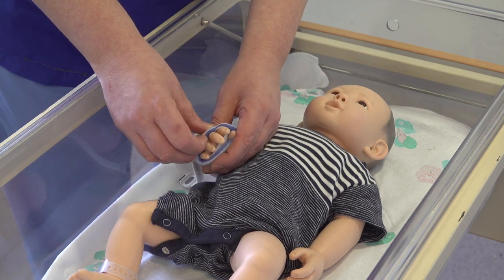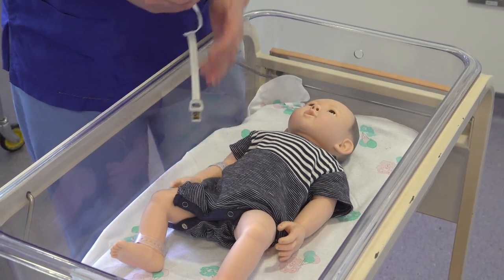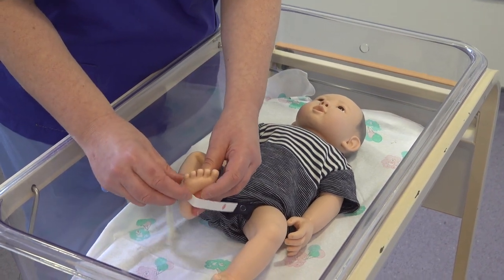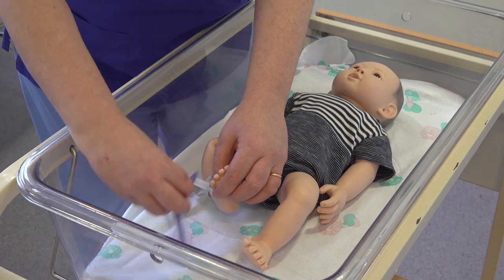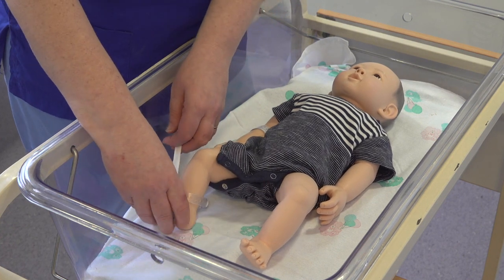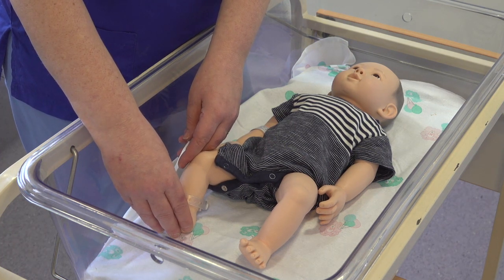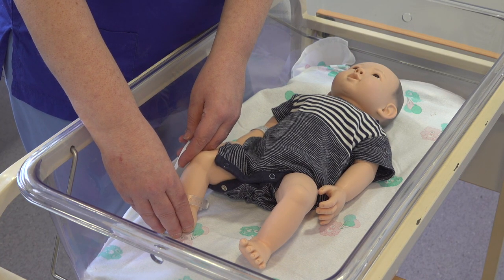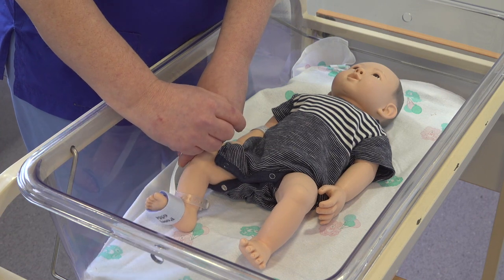You can use the same probe and we're now going to look at a post-ductal saturation. You can use any other limb for the post-ductal saturation — the left foot, left hand, or right foot. Place it in situ, put the saturation monitor on with a small posy wrap, and attach your probe to your monitor. Hold the foot to minimise movement so it doesn't interrupt the reading. Get your reading and record this as your post-ductal saturation. Also record which limb you took it on — the right hand for pre-ductal and the right foot or other limb for post-ductal.